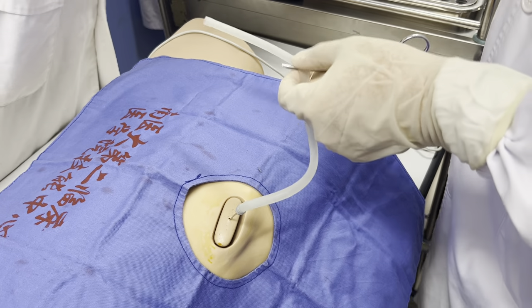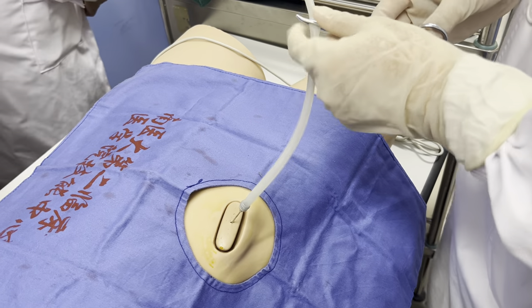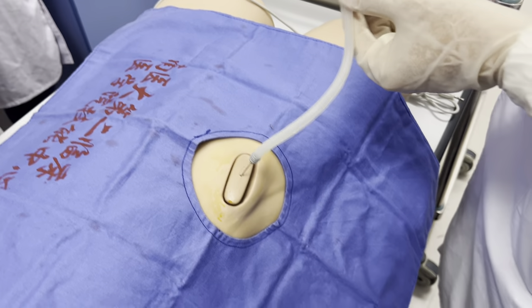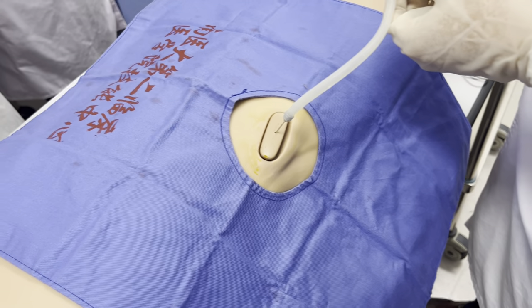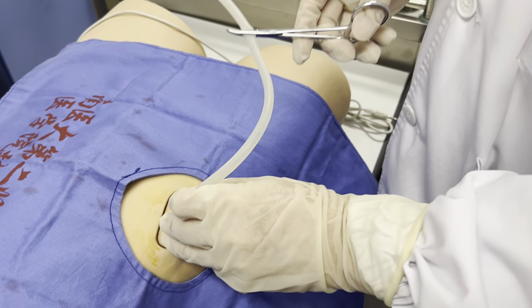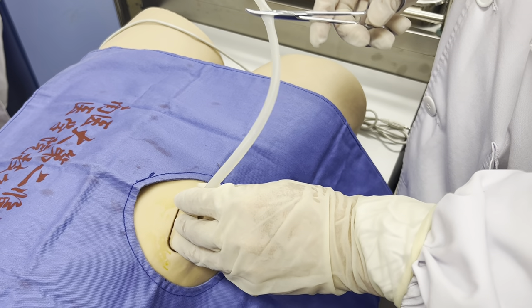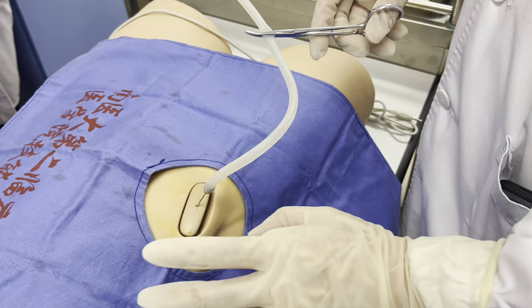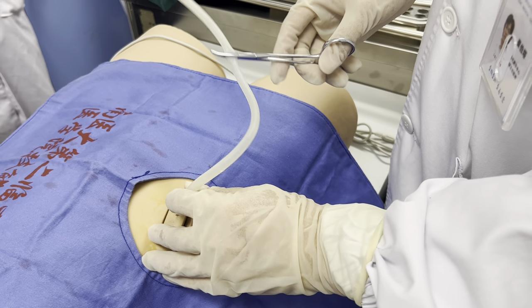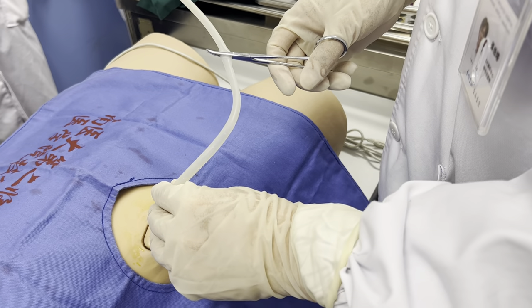we can use a large syringe, like 50 milliliters. For the first time we drain ascites, no more than one thousand milliliters. But for the second time, we can remove about three thousand milliliters.